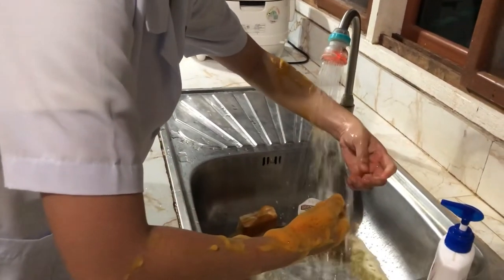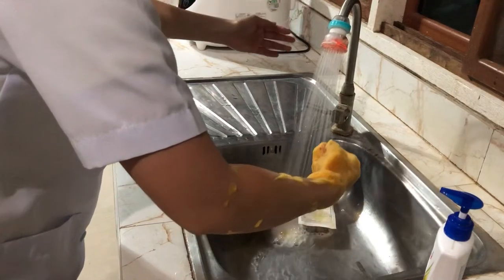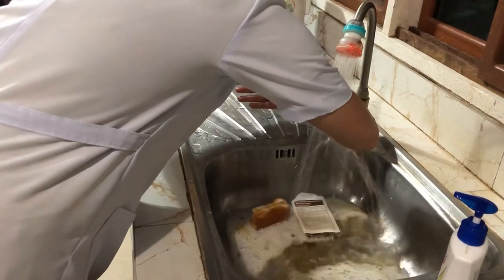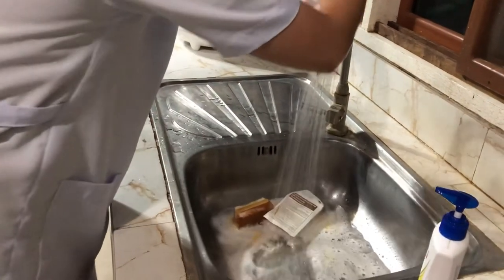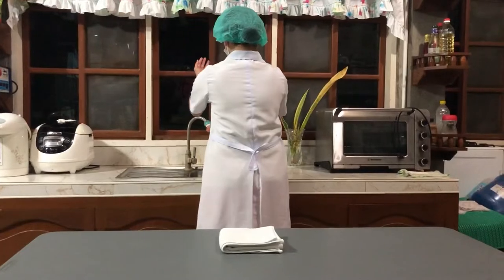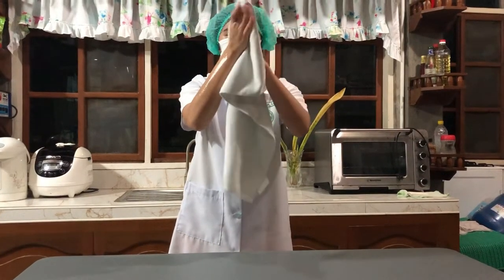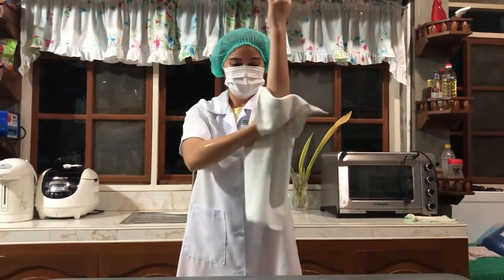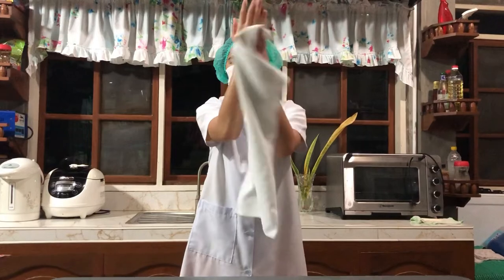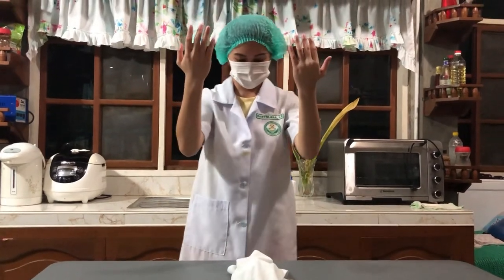After that, rinse the soap from your skin, allowing the water to run from your fingertips to elbows. Water should run from the area of least contaminated to the area of most contaminated. Use foot, knee, or elbow control to turn off the water to avoid contamination of your hands. By keeping your hands up and in front of and away from you, walk to the table where the towels are kept. Pick up the sterile towel by one end and allow the towel to unfold. Dry each hand and arm with opposite ends of the sterile towel, working from the fingertips toward the elbow, as drying prevents irritation of the skin and follows the principle of cleaning from the cleanest to the most contaminated area. Discard the towels properly, then keep your hands above your waist at all times.